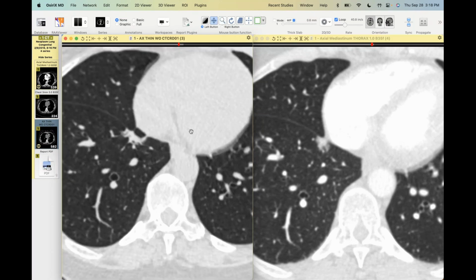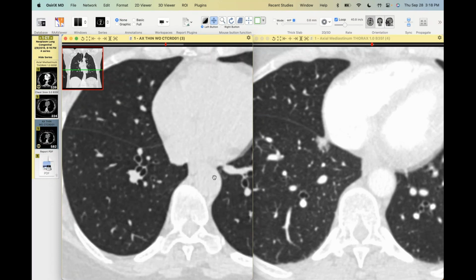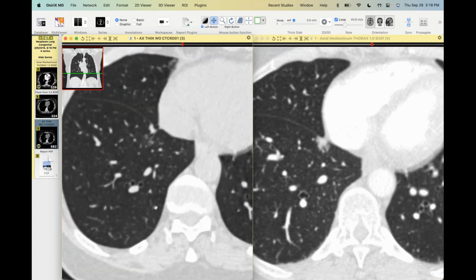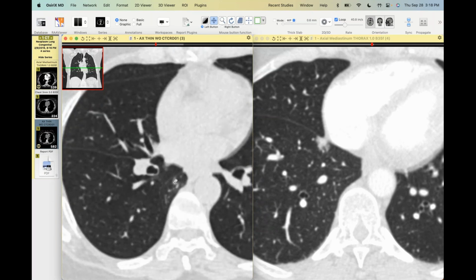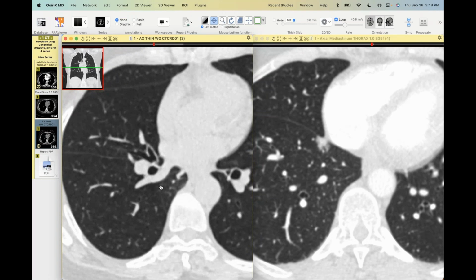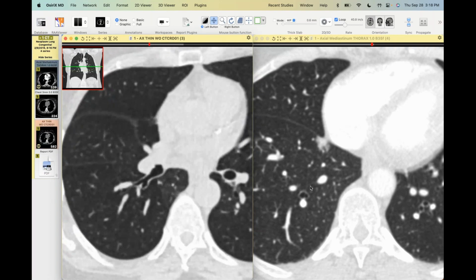I hadn't seen this one, and I was in the reading room and fielded the call when the surgeon called from the operating room. Because this is so deep, she was going to have to basically do an extended basilar segmentectomy. But her question was, what the heck is going on right here? Because she sees this funny little vessel arising from the mediastinum right there, closer to the superior segment, and also involving or adjacent to the pulmonary vein. And this is kind of interesting because it wasn't commented on in any of these studies.